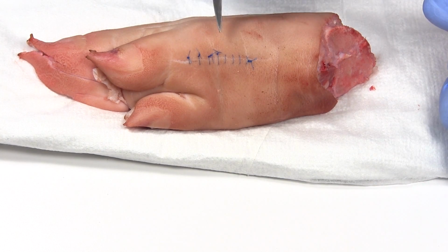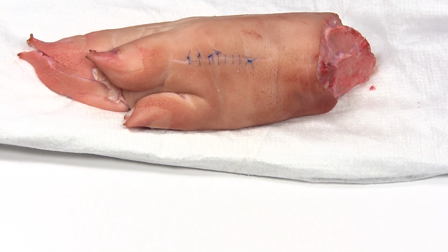So there you go. Overall, places to use this, places where there's not a lot of tension, places where it's going to be a little bit more conspicuous, you're going to see it. Once you get the hang of it, it's really not that hard to do. When you first start, it's maybe a little bit more intimidating, but really fine. It works out just well once you get into it and get comfortable with it.